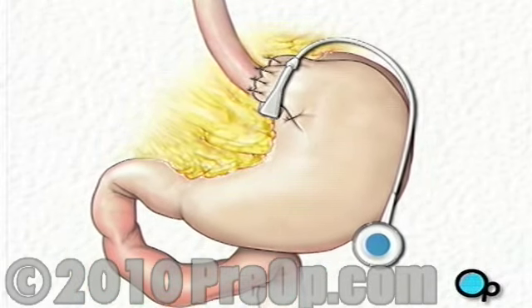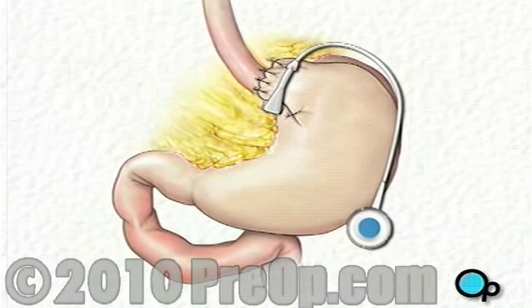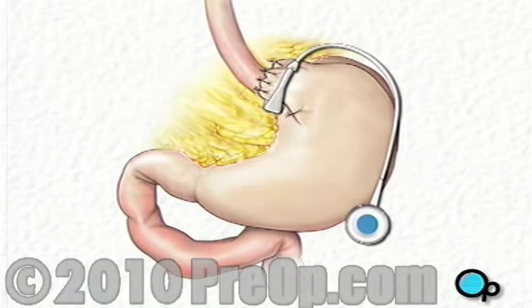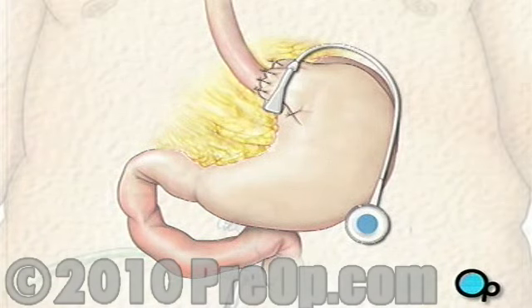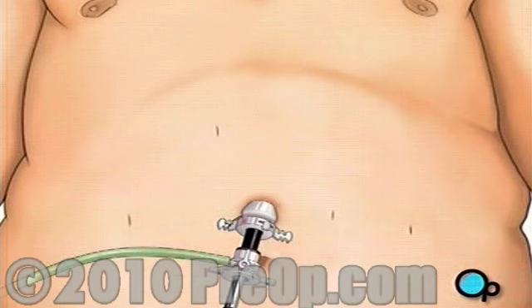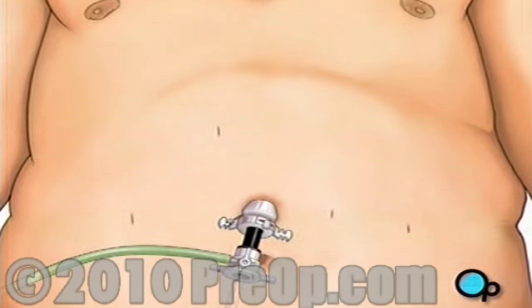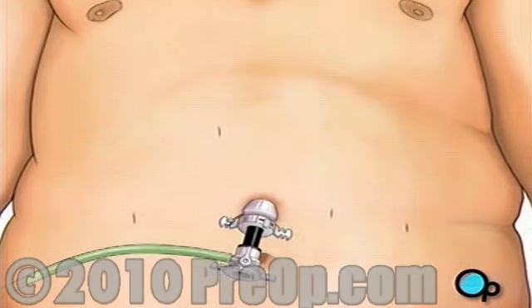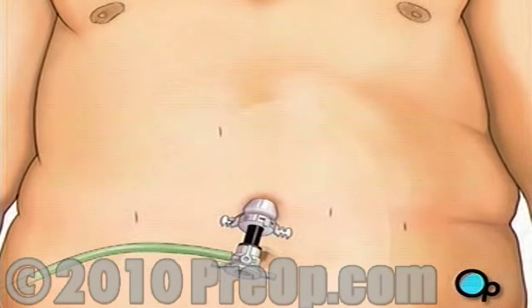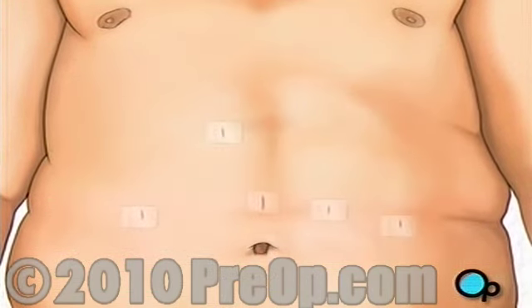This valve will allow your doctor to adjust the tightness of the band and control the size of the opening into your stomach. When the team is satisfied that the band is properly functioning, they will withdraw all surgical instruments and close the incision with sutures or staples. Finally, a sterile dressing is applied.